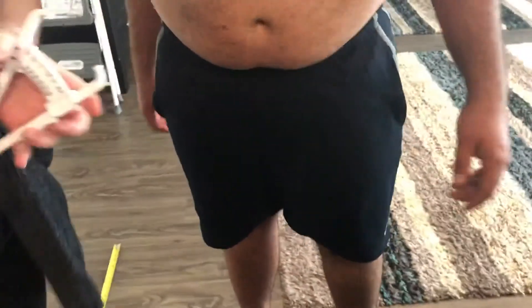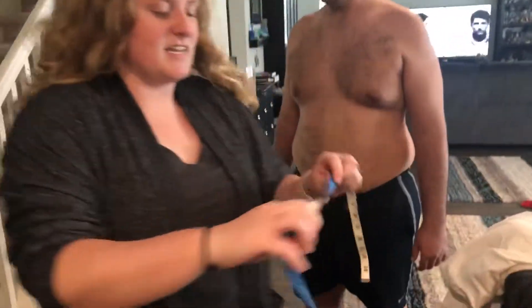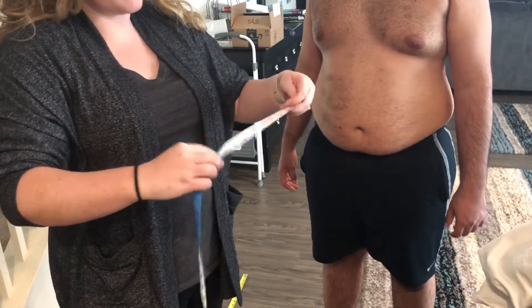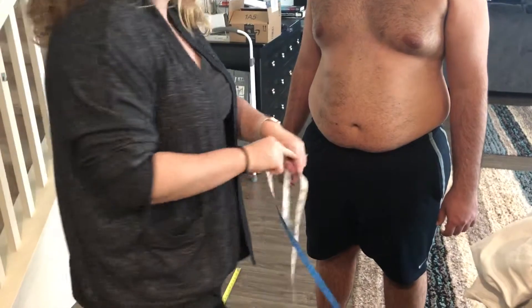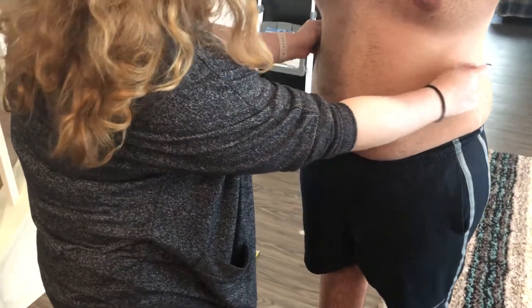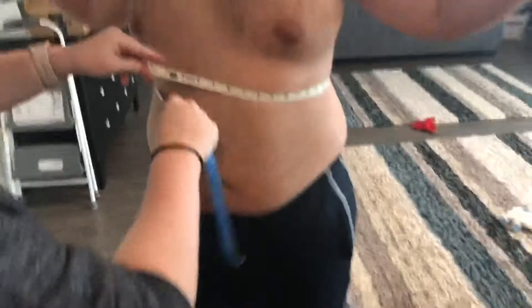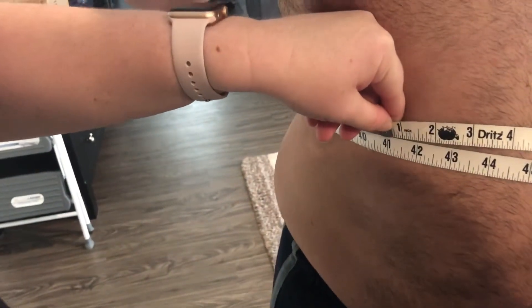So now we're gonna go ahead and measure his hip and waist. I have this fabric measuring tape right here, and we're gonna measure in inches. You want to go ahead and wrap it around him where the lowest part of the waist is — about right here — go ahead and bring it around, and he is about 41 inches in his waist.